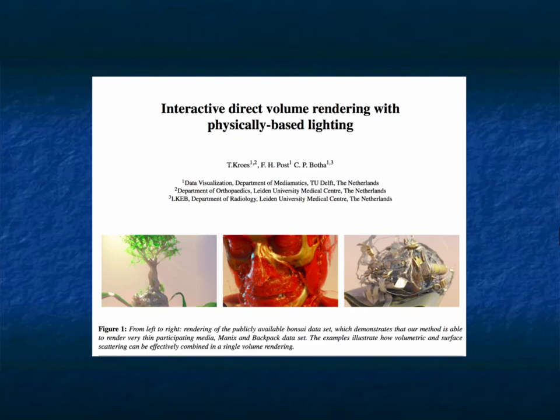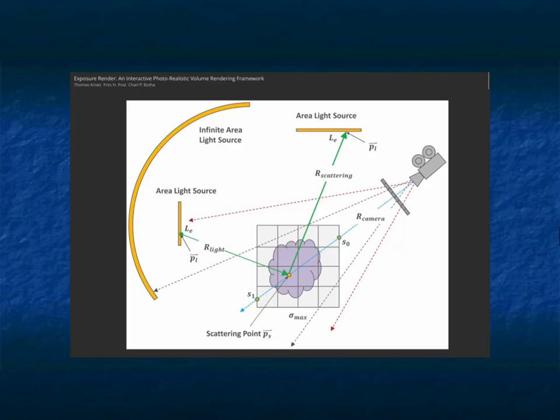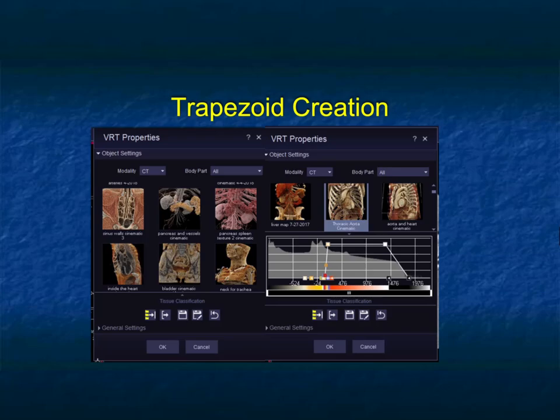Klaus Engel, a number of years back, as NVIDIA developed faster and faster chips, decided that we could volume render, but do it better because we can use different lighting models. And so he wrote an article talking about this basic infinite lighting model with shadowing. And shadowing is what helps make things stand out. Also, it's basically texture mapping. So we're looking at more subtleties. And Siemens took that work and came up with cinematic rendering, which we've been working on for the past 7 or 8 years. We've developed trapezoids. Well, trapezoids is how you look at the information.